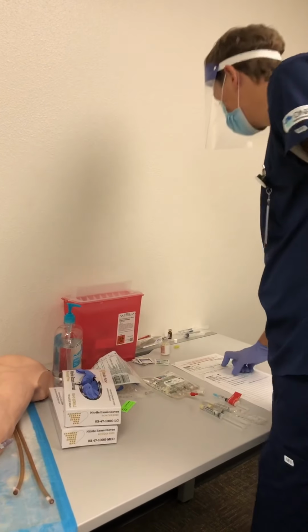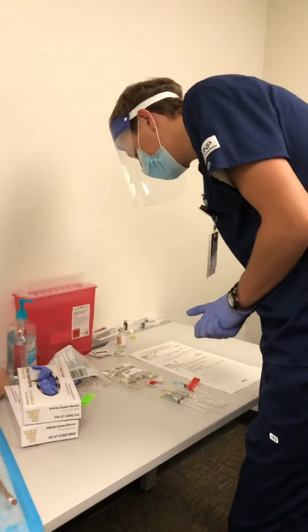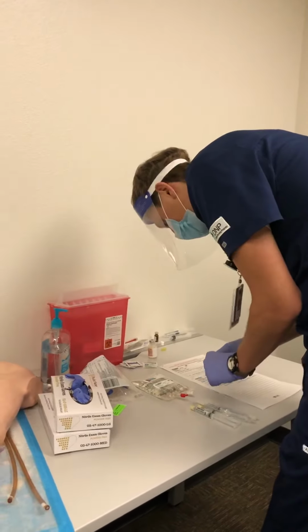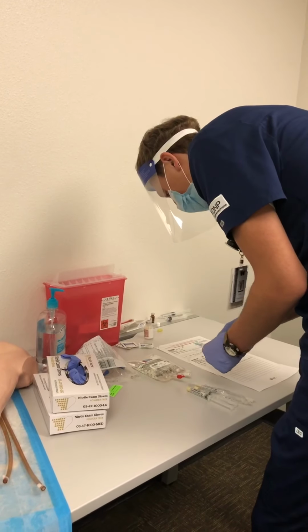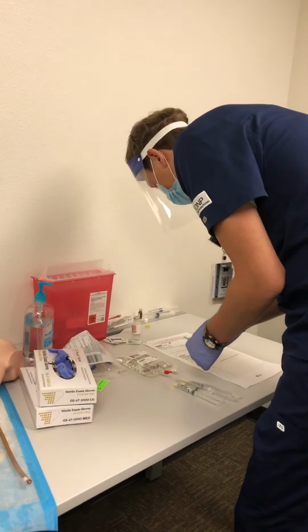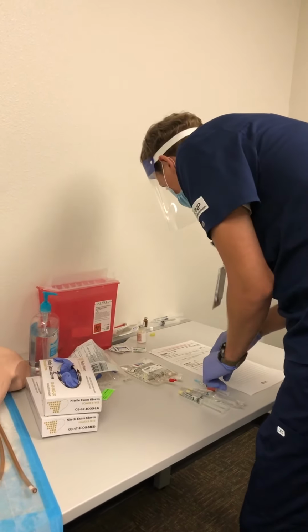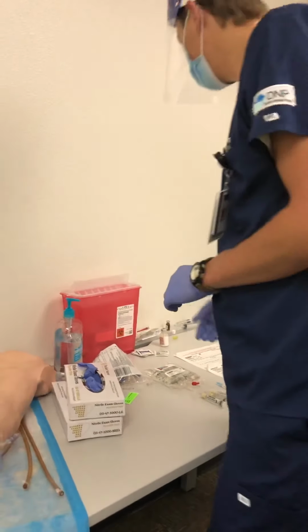I'm going to be doing that at 112 mils per hour, so I can go ahead and set my pump for that so it's ready for me whenever I get that hung. And then I also have my morphine here, which is at 0.4 milligrams with 1 milliliter of NS mixed to dilute it, and that matches my MAR. So I can go ahead and start instilling these medications to the patient.